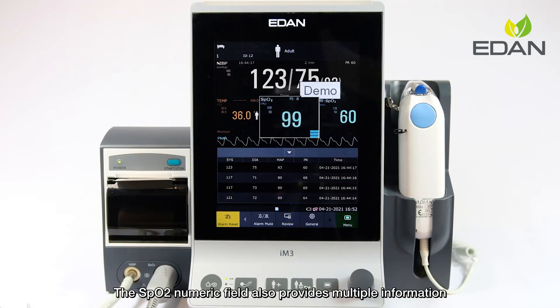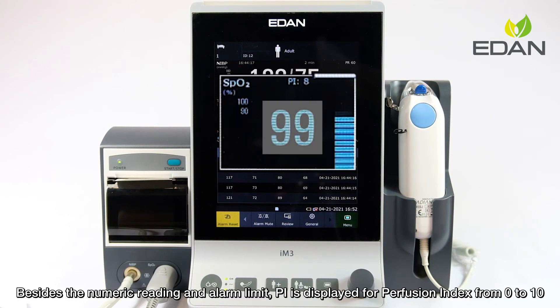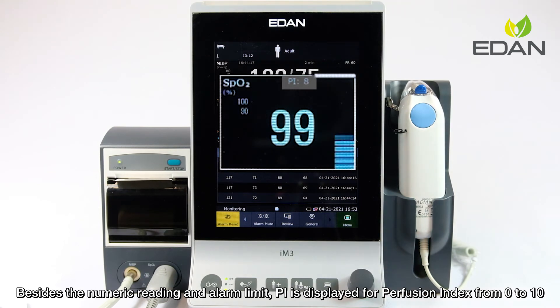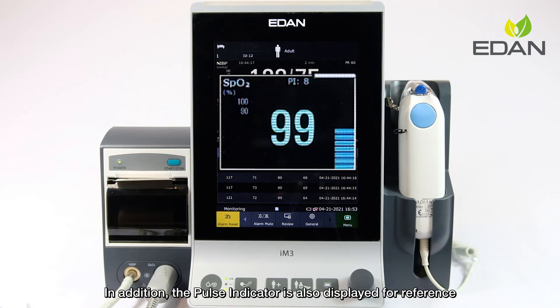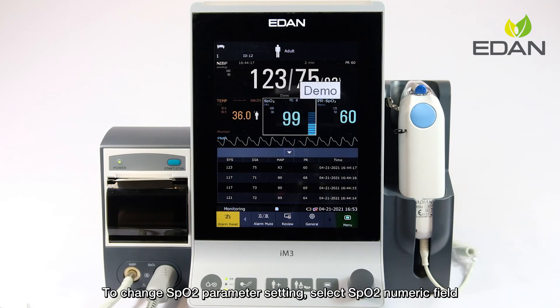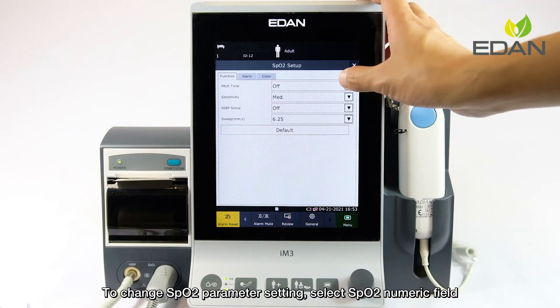The SpO2 numeric field provides multiple information. Besides the numeric reading and alarm limit, PI is displayed for perfusion index from 0 to 10. The larger the value, the better the perfusion and signal will be. The pulse indicator is also displayed for reference. To change SpO2 parameter settings, select the SpO2 numeric field.